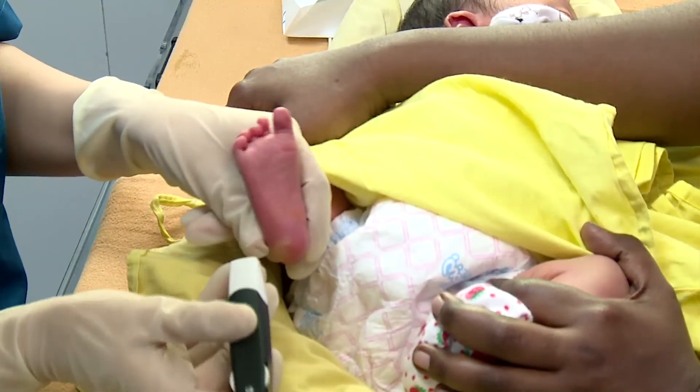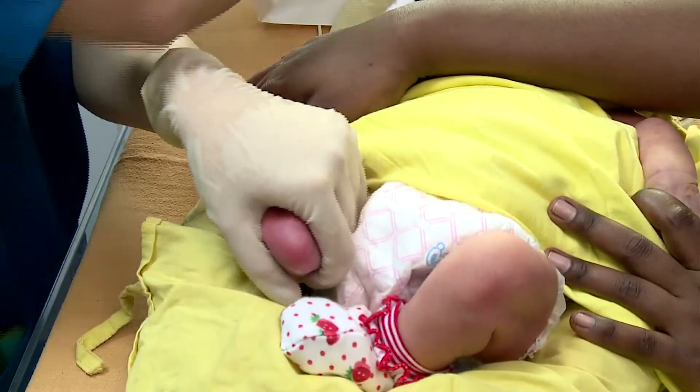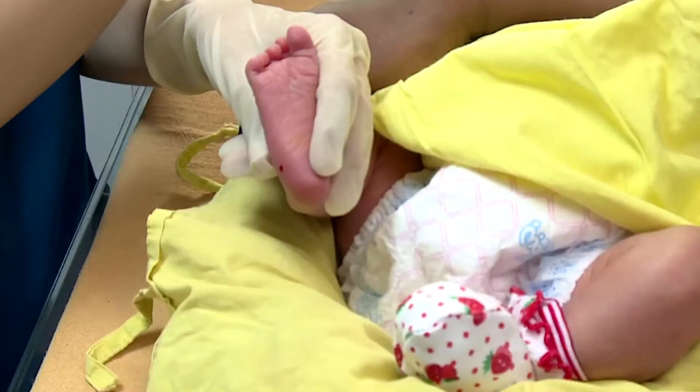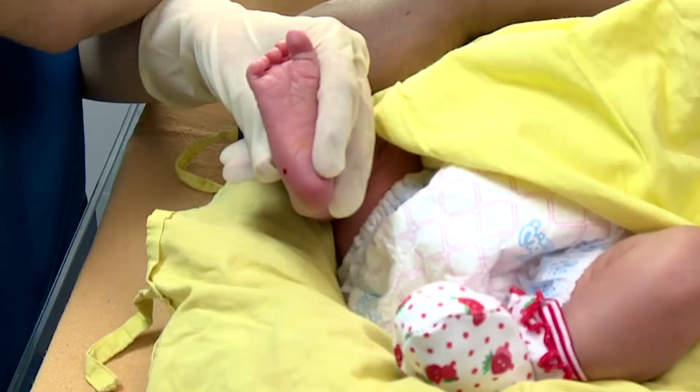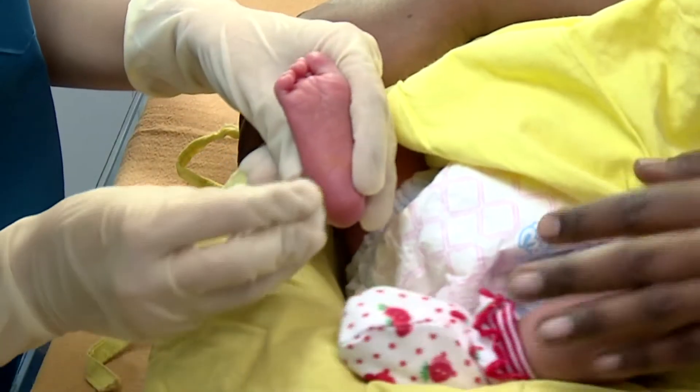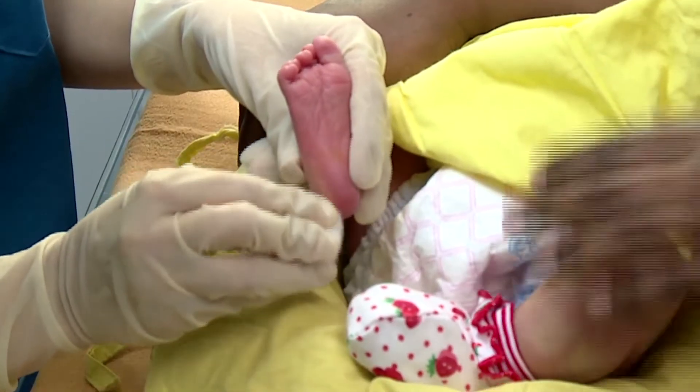Perform the puncture in the most medial or the most lateral portion of the plantar surface as suggested in the video. Following the puncture, the first drop of blood should be wiped away with a gauze, as it contains tissue fluids which may contaminate the specimen.